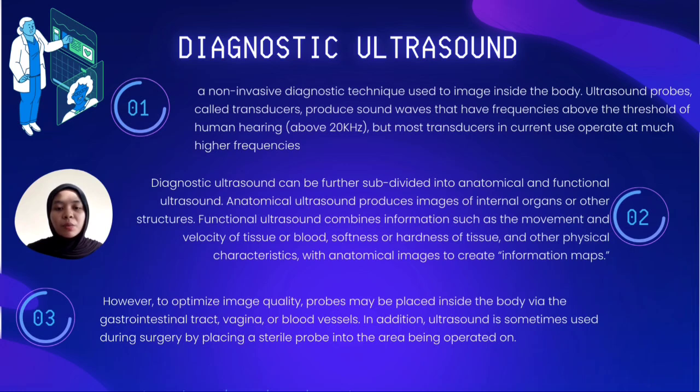However, to optimize the image quality, the transducer may be placed inside the body via the vagina or blood vessel. In addition, ultrasound is sometimes used during surgery by placing the transducer into the area that is being operated on.